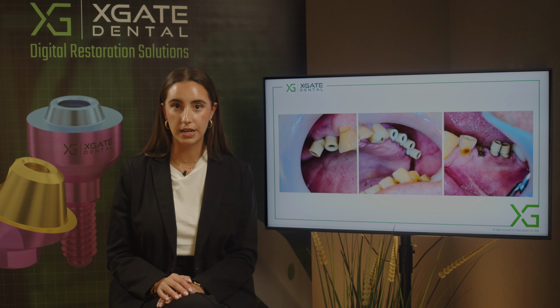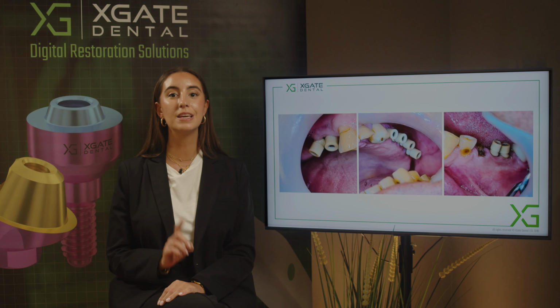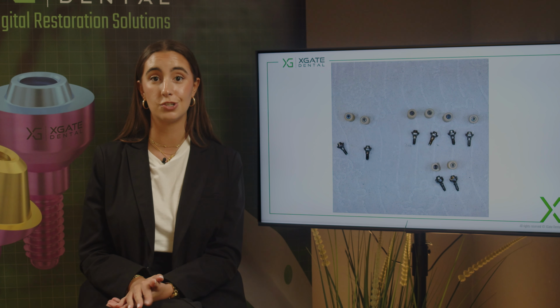When we cut those scan abutments, we don't throw them away. We keep those scan abutments that we took part of, and we save them for the next time we have a similar case where we might need to use them. Here you can see all the multi-units and the scan abutments that we used. Those two multi-units were very close to one another, and this is what was left of the scan abutment. The other scan abutments are full without any issues.